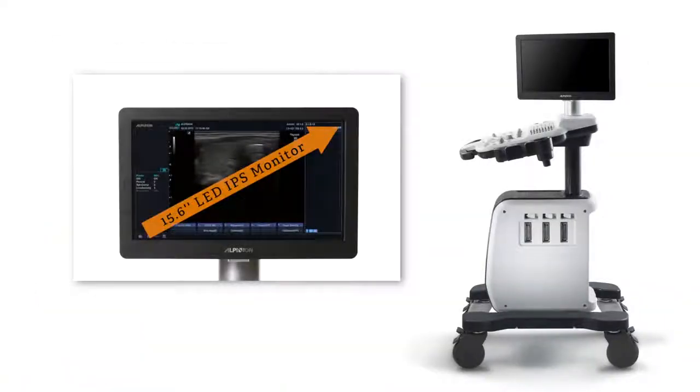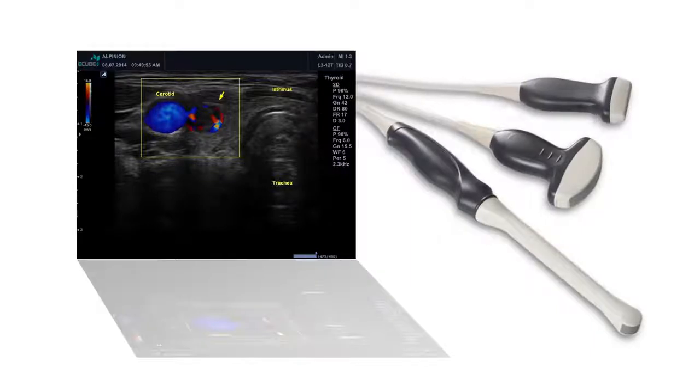The E-Cube's limits include a small-looking monitor, which actually still has a good-sized imaging area, and three probe options: a linear, convex, and endocavitary. However, more probes like a microconvex are on the way.